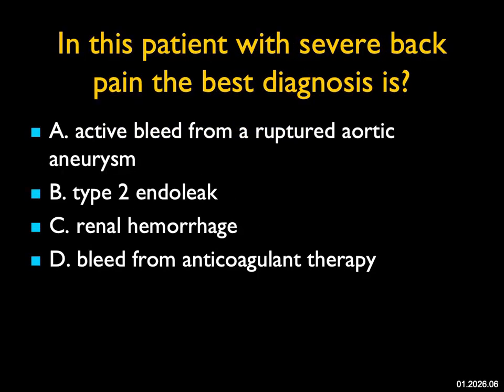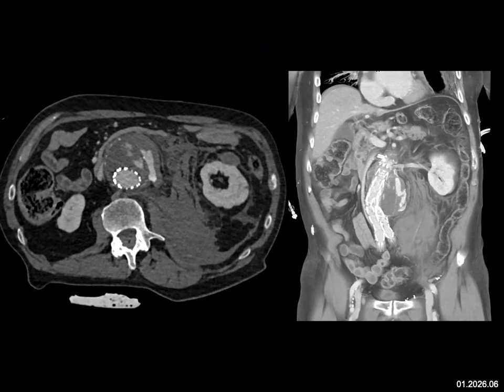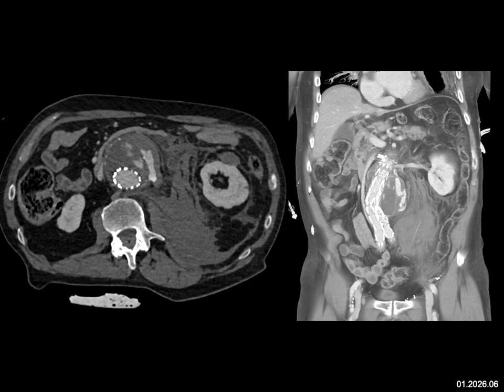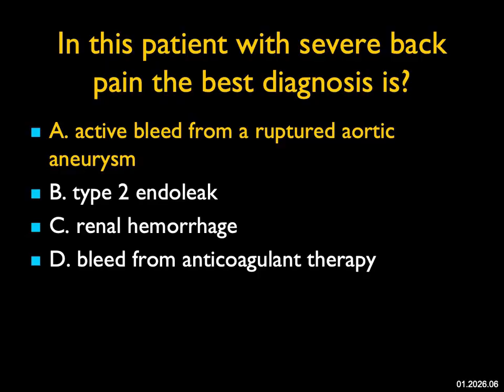In this patient with severe back pain: on the axial imaging you can see the patient had a prior endovascular stent and there's a large aortic aneurysm with active bleeding within the aneurysm and a large retroperitoneal bleed. The coronal 3D volume-rendered view shows the active extravasation from the aneurysm. This is an active bleed from a ruptured aortic aneurysm — a surgical emergency. It's not a type 2 endoleak, not renal hemorrhage, and not a bleed from anticoagulant therapy. The aneurysm has ruptured, explaining the large retroperitoneal component.